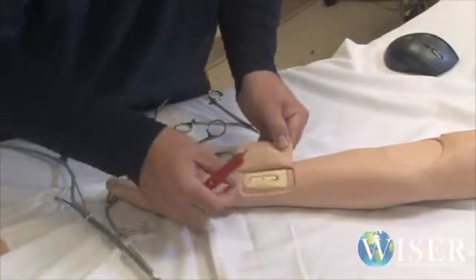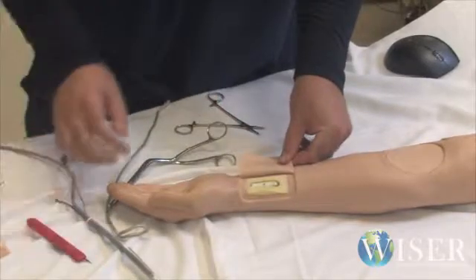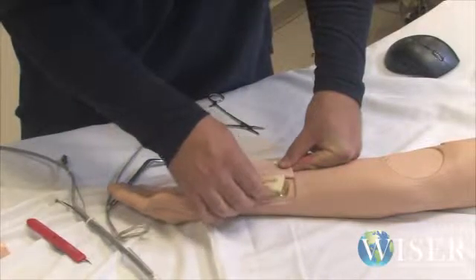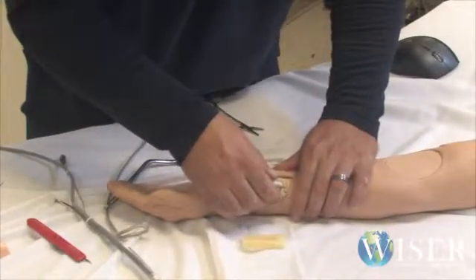And the other side kind of comes up. And I would just leave the other side on. No need to cut it, because you have your access. So the first thing you want to check is that your module is connected. So you can get right in there and pull your module up.